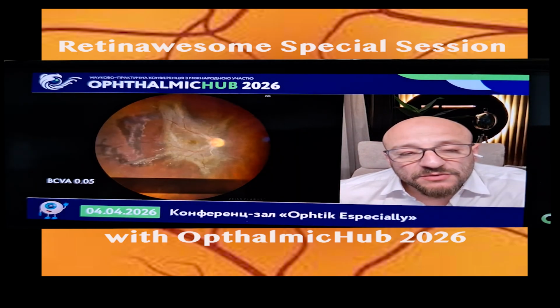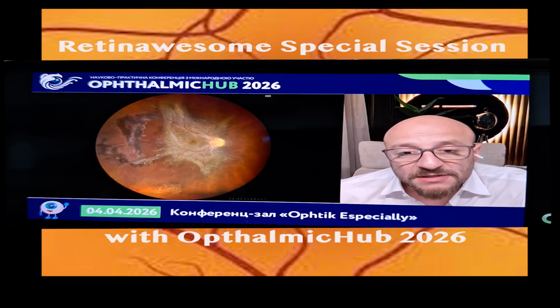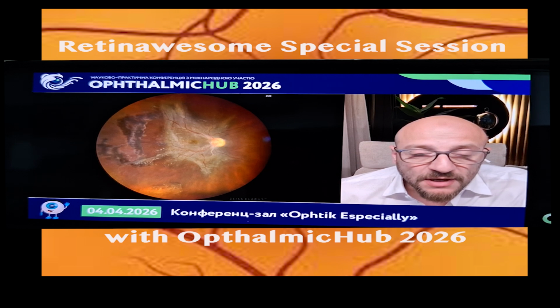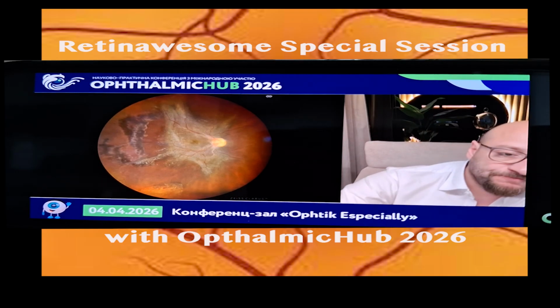This is the final visual acuity, which is 0.05, and as you can see, the disc is not covered now by the retina, or at least the fold over the disc is resolved in just 3 months. So the message here is just to remove the traction, try not to create any breaks, and the retina will recoil in a satisfactory way. Just give it time. Thank you.